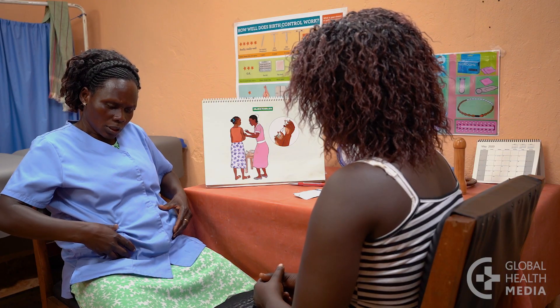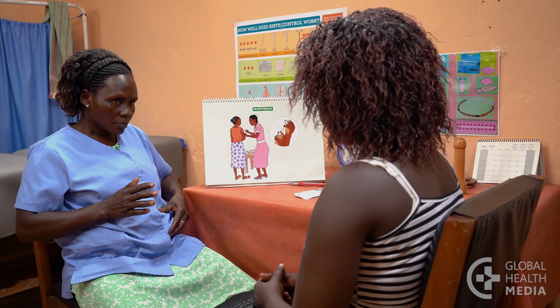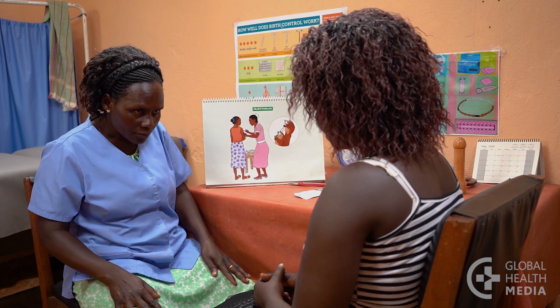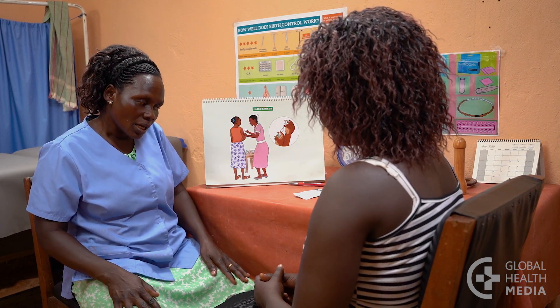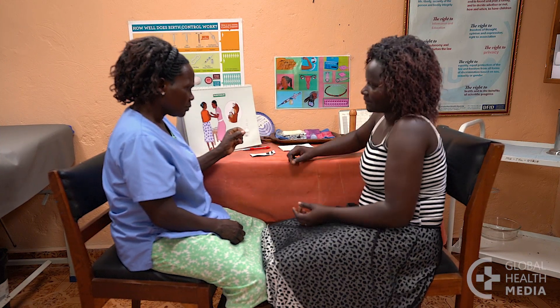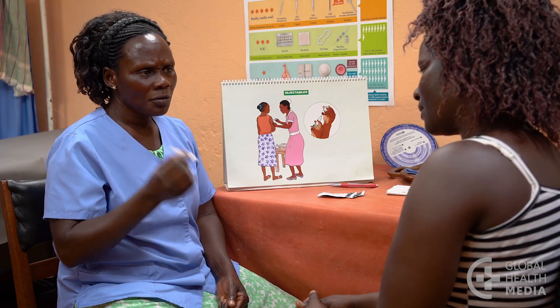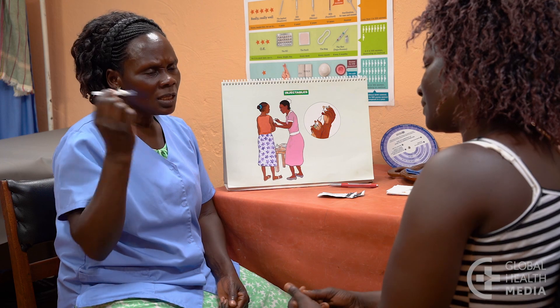The injection goes in the fat of the belly, but not at the navel, or in the front of the thigh. Show the woman the steps. First, mix the medicine: hold the device by the pot and shake it well while counting to 30.